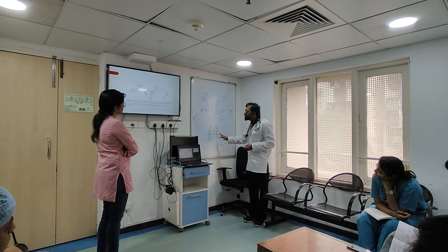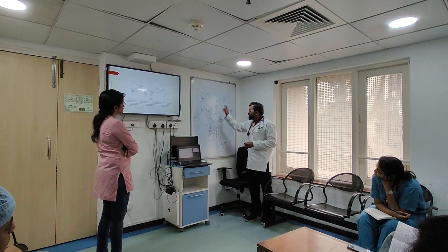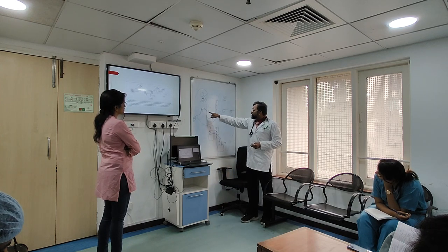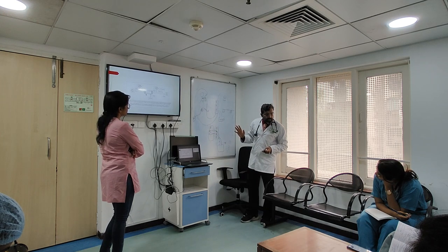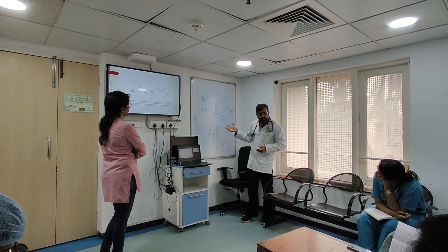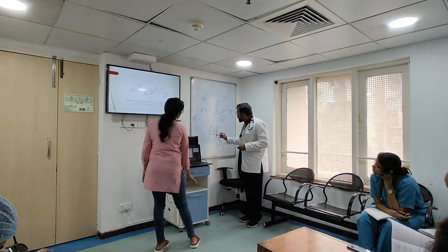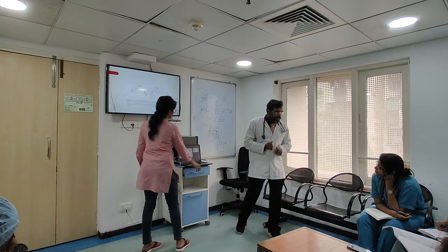Do I have to add anything more here? No. Because I don't have anything more here. All I'm having is a filter. I'm having an effluent bag which is down, the bag that drains from below. I'm having a replacement coming from the top that is going inside this. And I'm having a blood pump. I don't need anything more than this. Clear? This is CVVH. Did you understand? So in this, where will the treatment effect come from? The treatment effect I'll find by finding the effluent again. Understood?